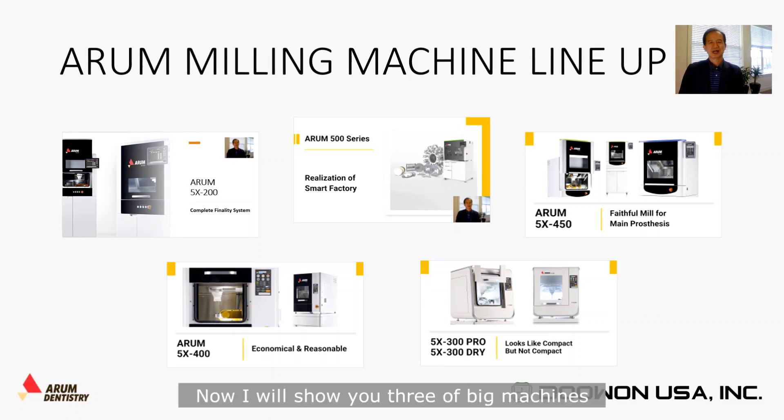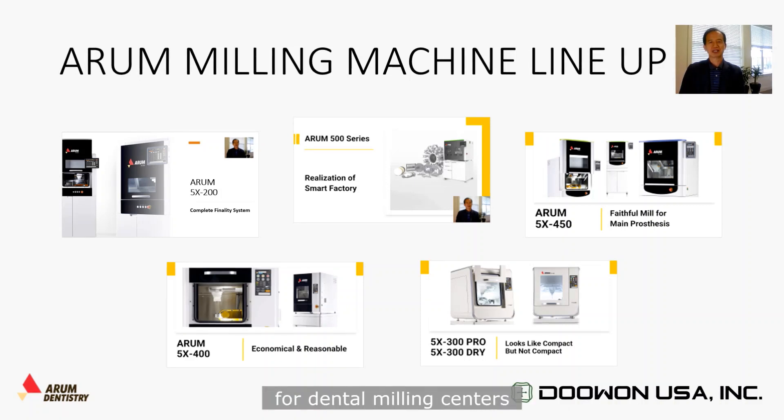I have to show three of the big machines for a dental milling center or a big dental lab — the bottom milling machine's portfolio and comparison with any other competitors.